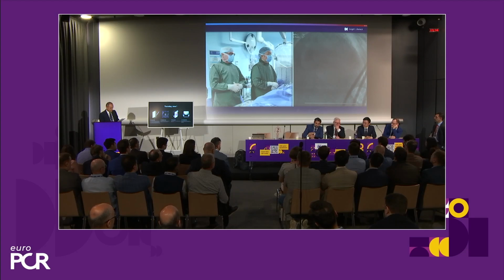Let's start with Carlos. Certainly physiology to understand how severe is the disease and what is the distribution of disease, and imaging to guide the PCI.